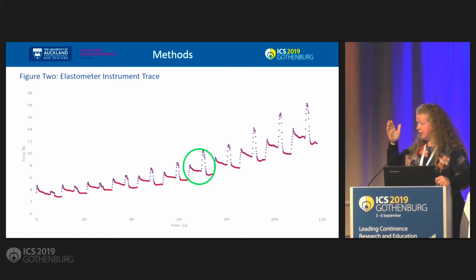No, the device stays open at each aperture as it continues up. Okay, so if you're stretching it and then you're letting it relax, how are you measuring it? That's what I'm saying. If you relax it completely, how are you actually measuring the force? I'm not quite sure I understand the question, but at each level, the force sensors are picking up what force is delivered through the sensors or the device.